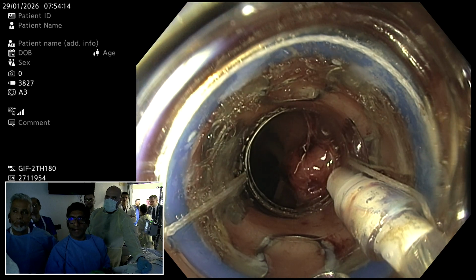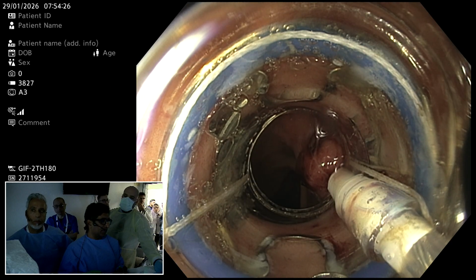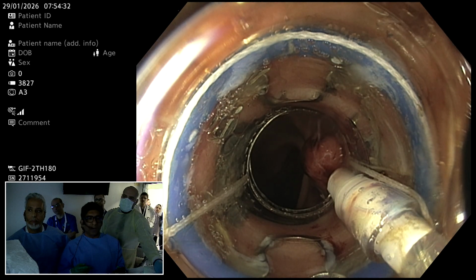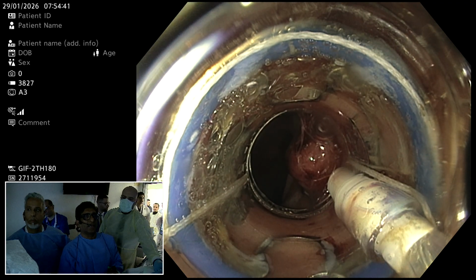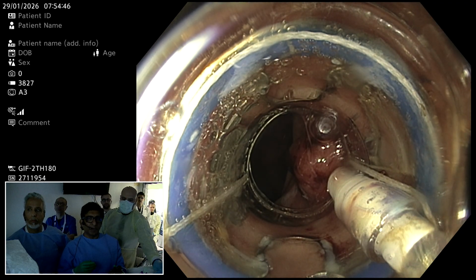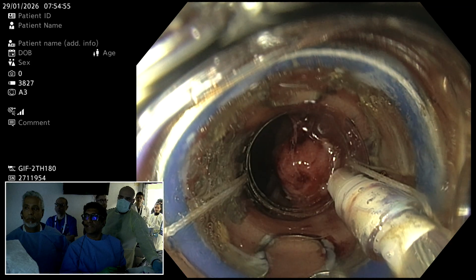Okay, so we have many options available to treat neuroendocrine tumors. One is band EMR, which is the easiest one, but it is for only submucosal lesions. But those touching the muscle need full thickness resections. The duodenal wall is very thin, and doing ESD in the duodenum is quite challenging because you may perforate. So other options are to do freehand EFTR, that is full thickness resection, but we have to be ready with the closure devices.